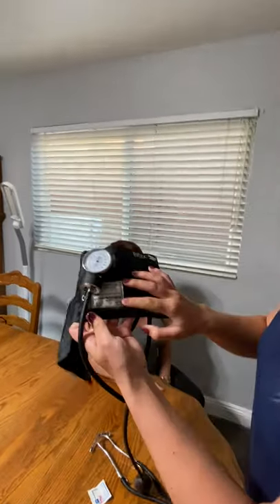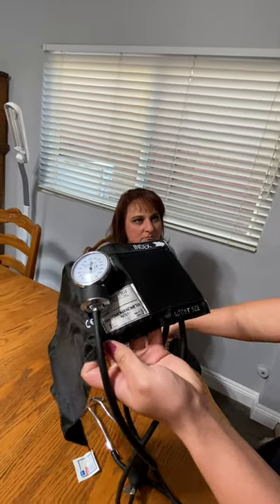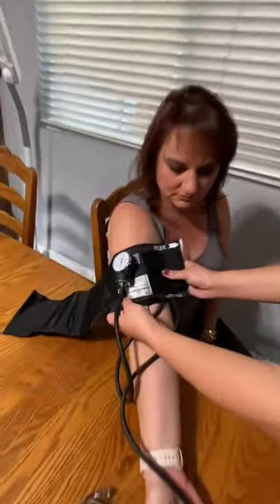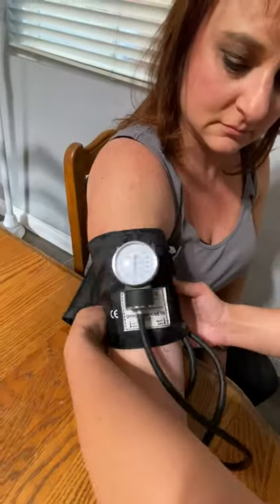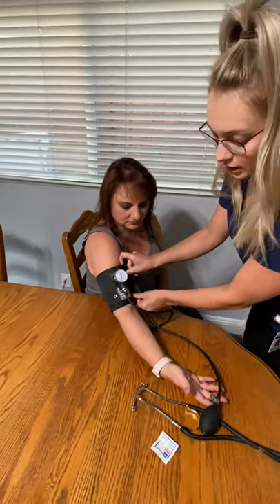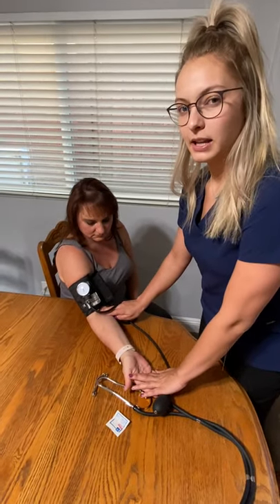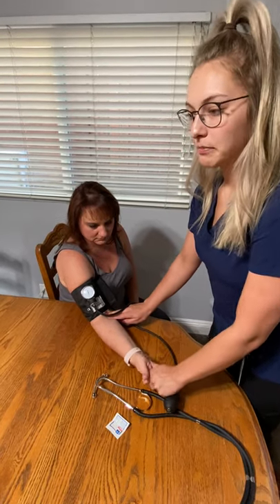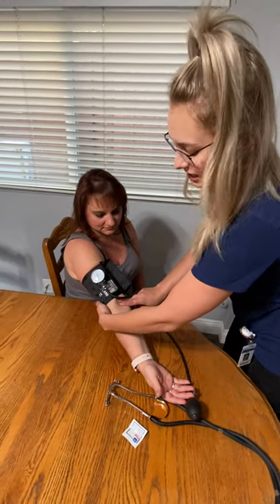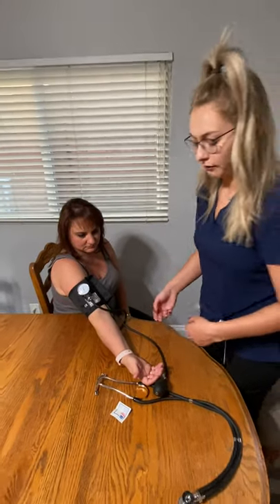We are doing her right arm, so her brachial artery is going to be in line with the arrow on the cuff. A good way to find the brachial artery is to go from the pinky and trace up — you'll be able to palpate it. If you can't feel it, try having them put their arm out straighter and just play around with it; you'll get more used to palpating it over time.